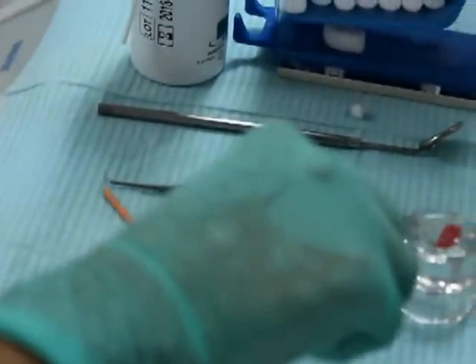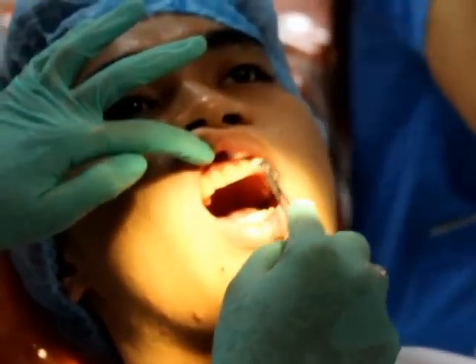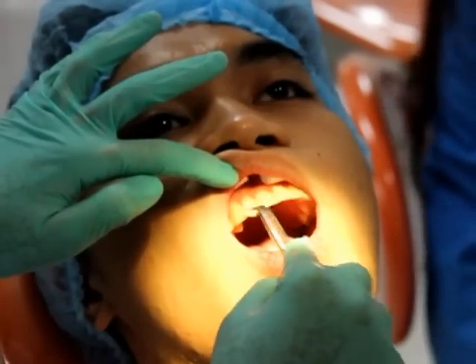Okay? Next, heat test. With a heat test, the same thing, you have to isolate the tooth and dry. Since you're going to use heated gutta-percha, you have to put Vaseline on the tooth. Why? Because you don't want this to stick. So put Vaseline. Apply Vaseline on the tooth so the gutta-percha won't stick. I place it on the 3 teeth that you're going to use.